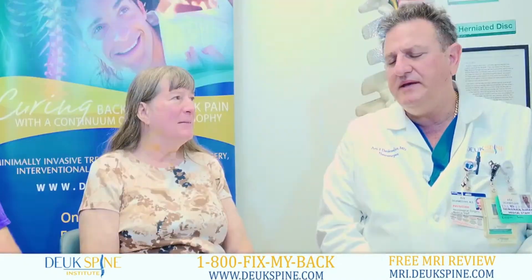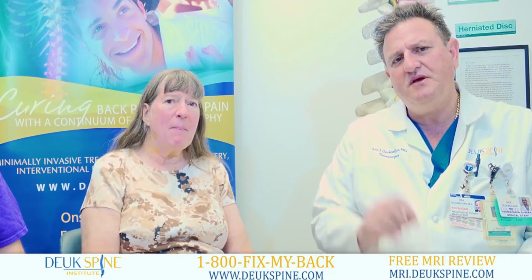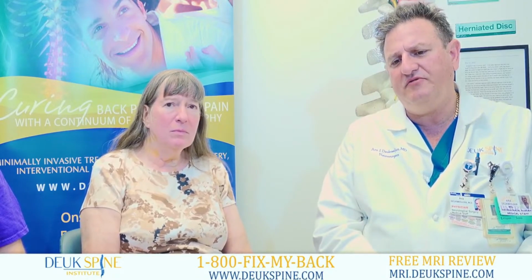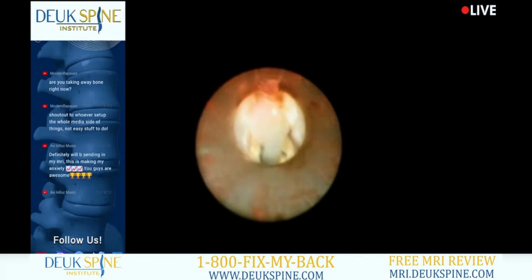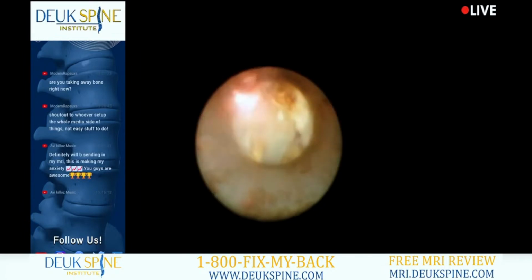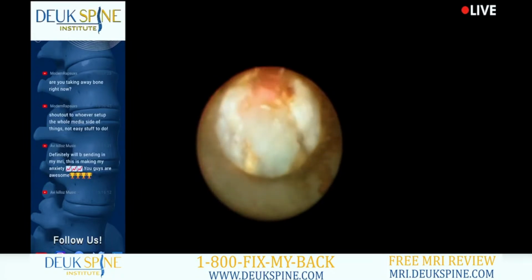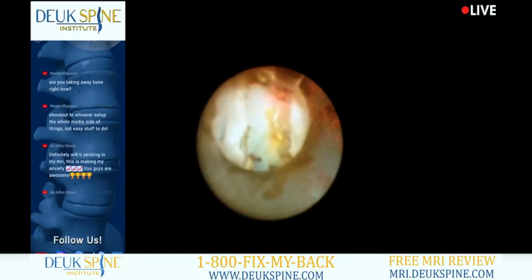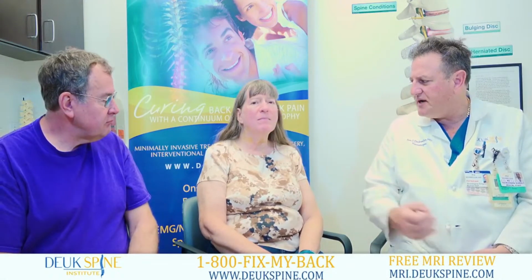Yeah, that's because she had a herniated disc, two of them, C4-5 and C5-6, and the herniations were literally sitting on the nerve. If you watch this video segment right here, you can actually see there's the laser, and as we're removing the herniation, it literally pops right out of the foramen where it was sitting on top of the nerve, crushing the nerve. The surgery was a success. We lost almost no blood at all, and you can see your incision is tiny.